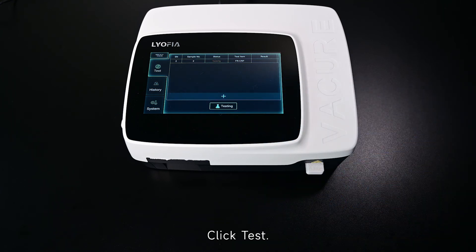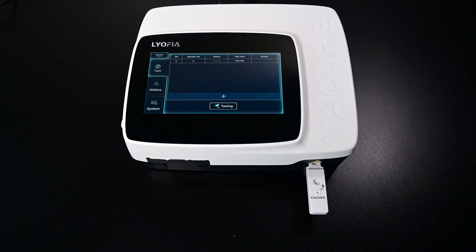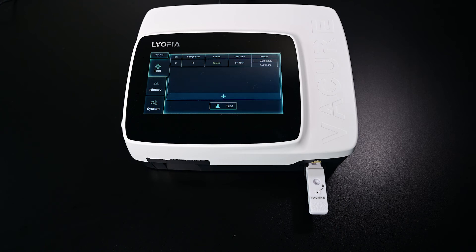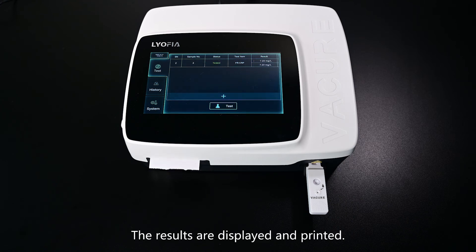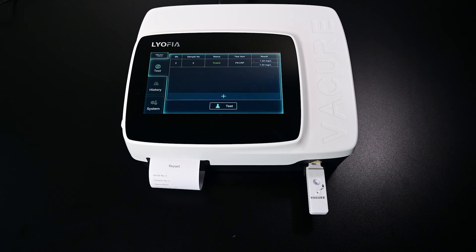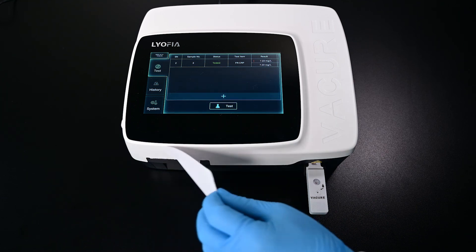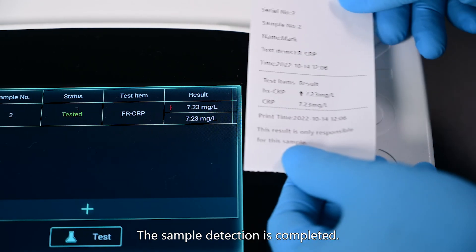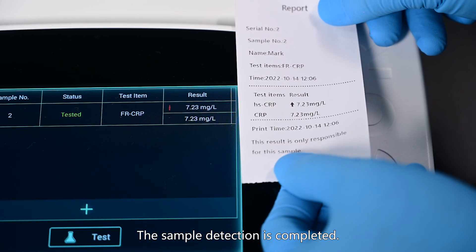Click Test. The results are displayed and printed. The sample detection is completed.